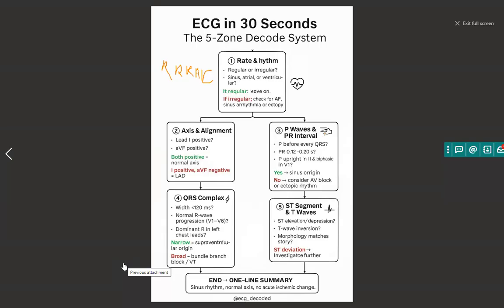If they give you an ECG to read, you want to know the story. Where is this patient? No matter what ECG I'm being given to read, no matter how normal, I want to know at the end of everything, or early on, depending on how quickly I read the ECG. If I read it in 30 seconds, then the next minute I'm asking, how is this patient, or what did they come with, or where are they, right?